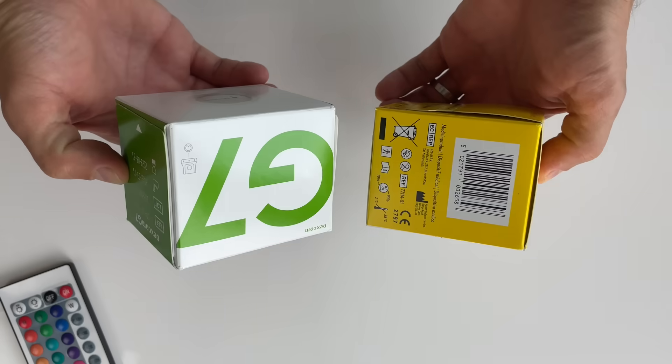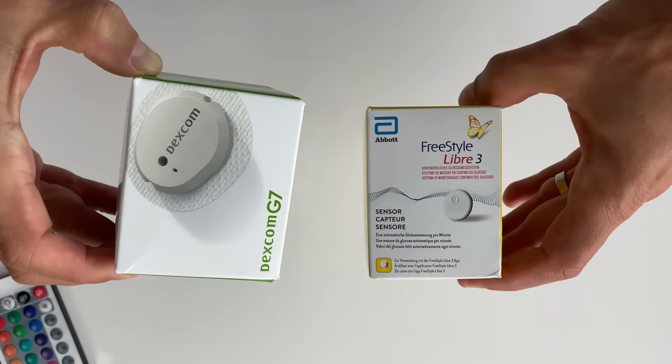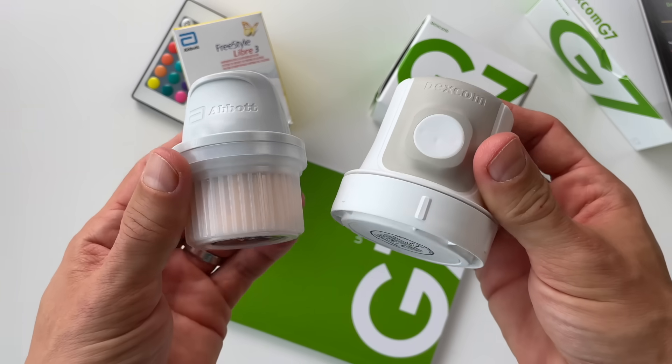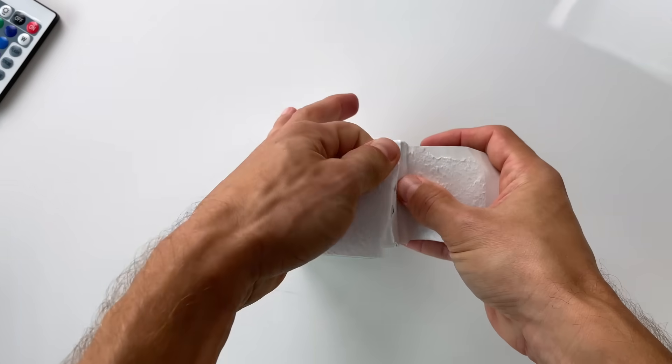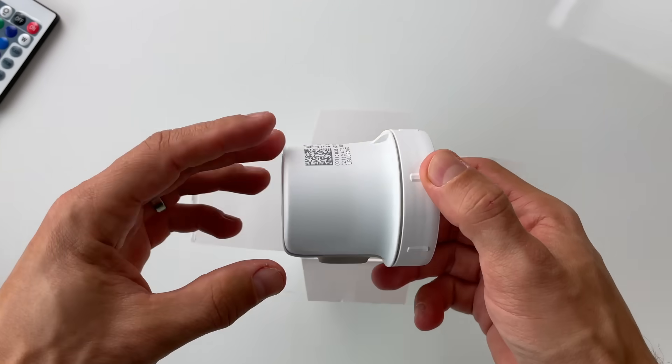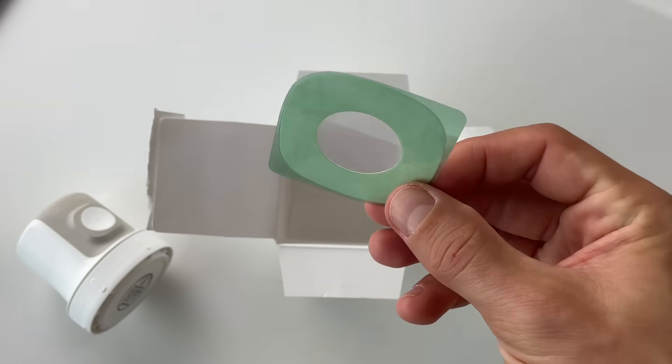Now let's talk about differences between the G7 and the Libre 3. In total, I found 8 differences. Difference number 1 is quite obvious — it's the sensor design. Both of these sensors come in very small, compact packages. Libre 3 has a slightly smaller box and applicator, but overall the packaging is fairly comparable. Dexcom G7 comes with a free overlay that you can place over the sensor to keep it secured, while Freestyle Libre 3 doesn't come with an overlay.